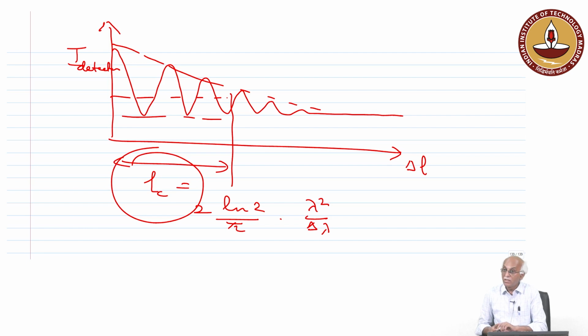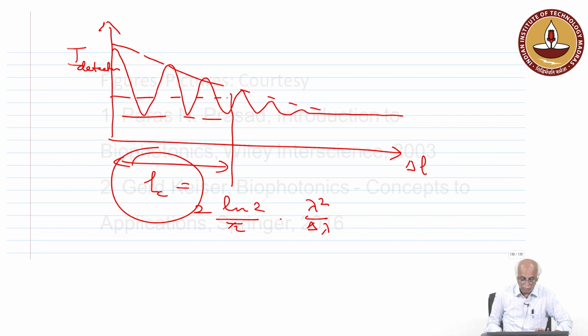Tomorrow we will see how to observe the depth information further. For that, of course, as simple as you move the reference mirror arm M1 by a small amount, then I will see on the other side a little bit more depth information from the tissue. We will see tomorrow how exactly we are capturing information. It is hidden in terms of refractive index change. Okay. We will see it tomorrow and go ahead with tomorrow's class and different approaches, what are the modalities that we can use to capture this information.